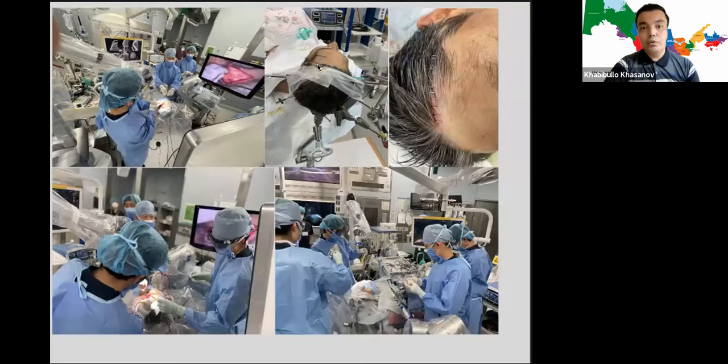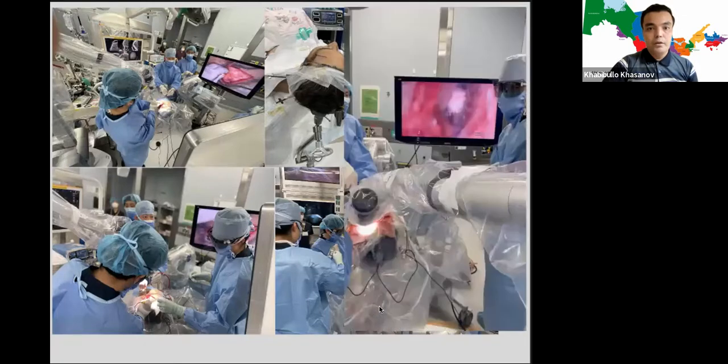This is quite comfortable because the patient is facing the endonasal surgery team side, and it is convenient for the transcranial surgery team too. The skin incision is along behind the hairline. The use of the exoscopic system is better because we have deep visualization in a 3D format.